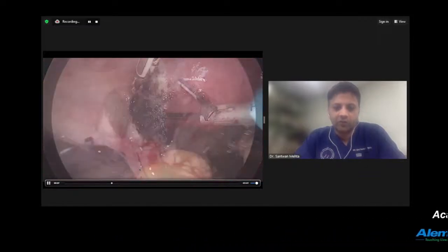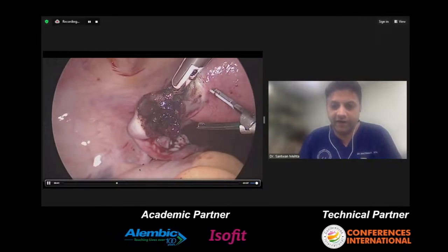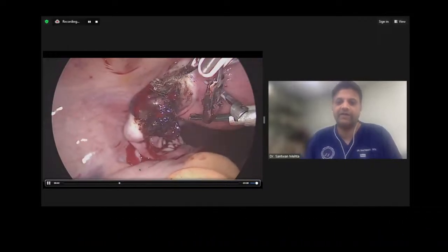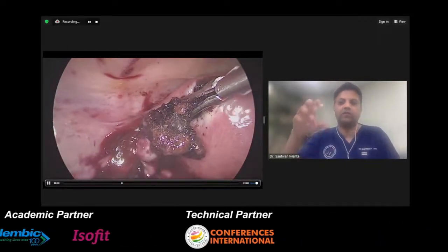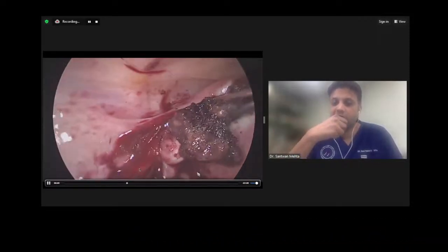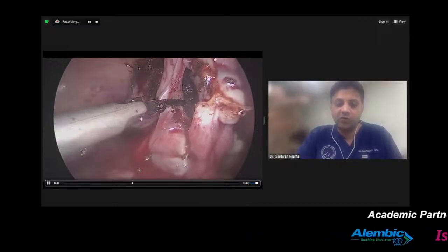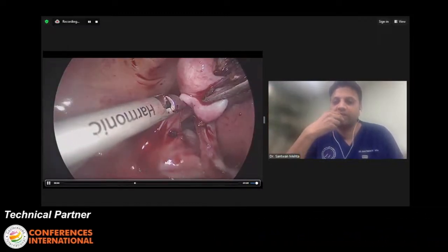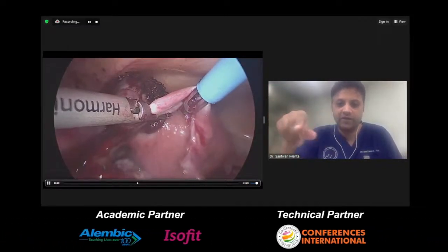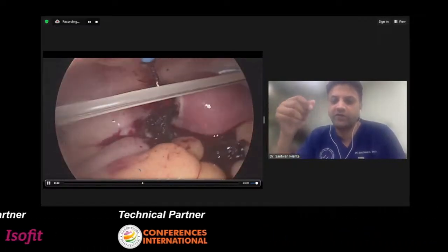Here what we are trying to do is find an endoloop or something similar, which prevents the blood supply to this ectopic mass from the uterus, so it will be easier to achieve hemostasis and then easily remove this mass. To apply the proper endoloop, I'm removing the excess tubal part. Then I have introduced the endoloop, which is a chromic catgut loop.